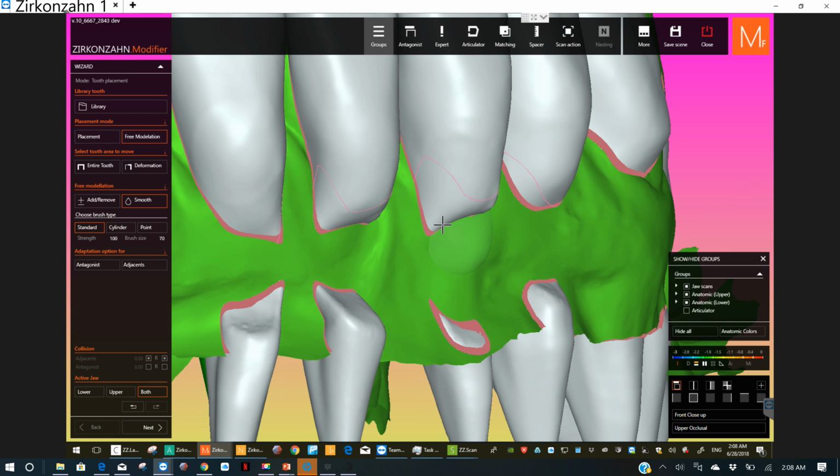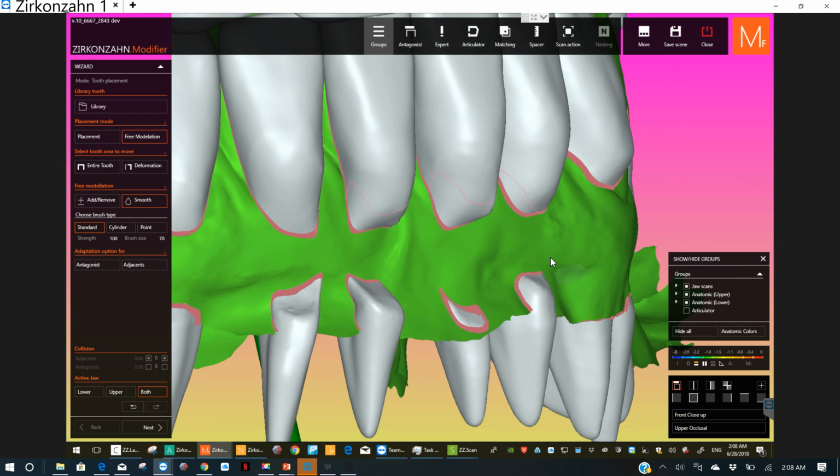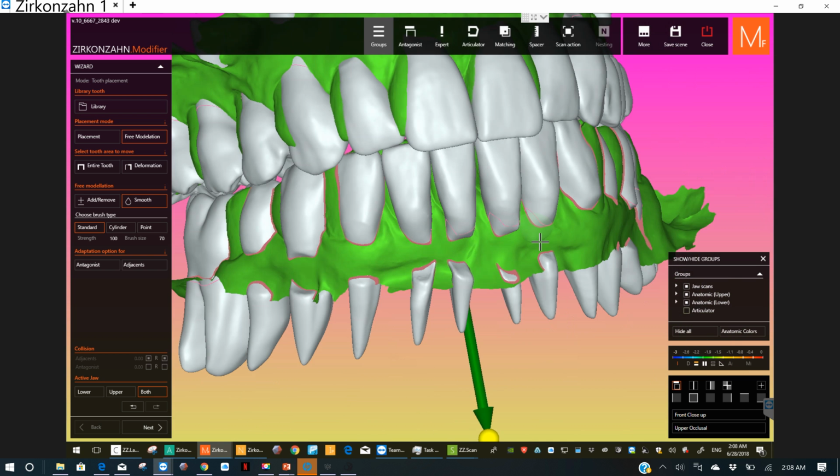And if we have to make some changes on the day they come in for their surgery, we'll just snap another face on her and make sure that we make their final bridge have those too. So like if they came back with a bunch of sores right here, there's a hint that you better smooth it. And people's jaws will be in a better spot because this is kind of like wearing a fixed orthotic.